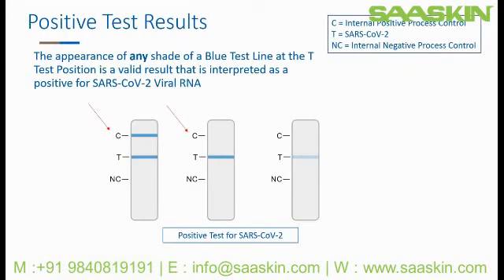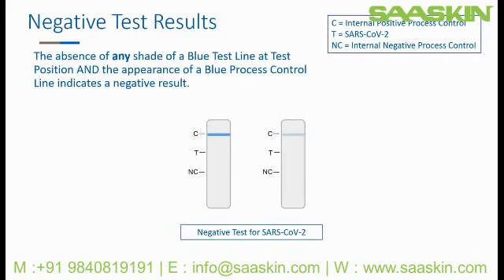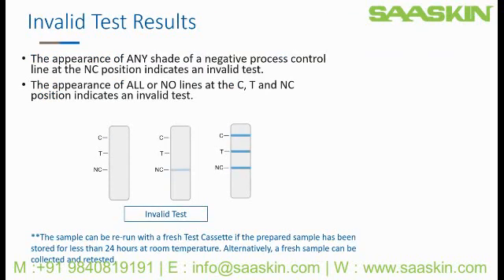Here are positive test results for SARS-CoV-2. Be sure to look closely when interpreting the results. Any shade of a blue test line at the T test position is a valid result that is interpreted as a positive for SARS-CoV-2 viral RNA. Note that a valid positive result is with or without the presence of a control line at the C position, and any shade of a blue test line. The absence of any shade of a blue test line at the T test position, and the appearance of any shade of a blue control line, indicates a negative result for SARS-CoV-2 viral RNA.